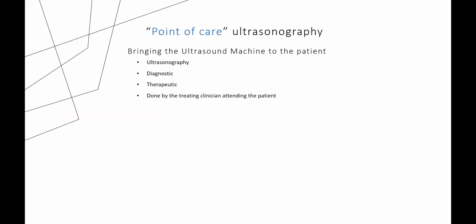what we are doing in the ICU in our daily life is point of care ultrasonography, in which we bring the ultrasound machine to the patient. Okay, so ultrasonography is the study of using ultrasound for diagnostic and therapeutic purposes, and the ultrasonography itself is done by the treating clinician attending the patient at the point where the patient is being treated.